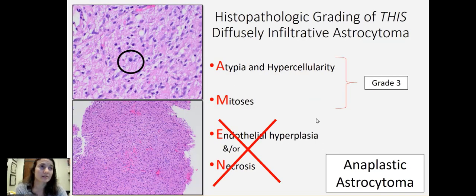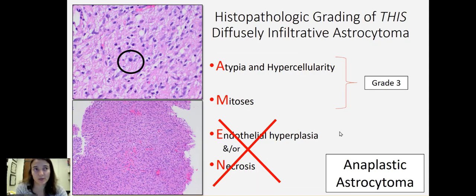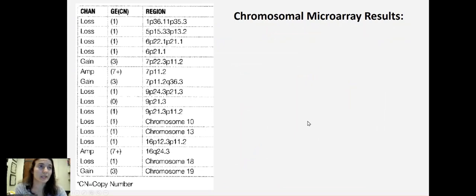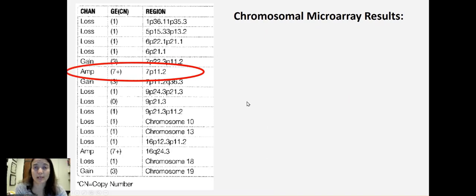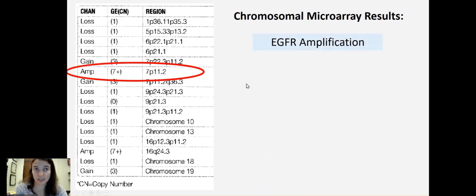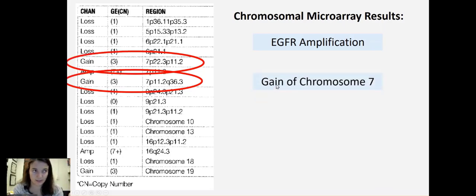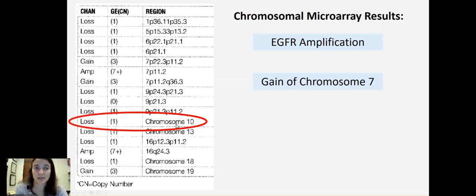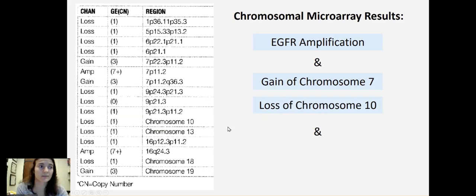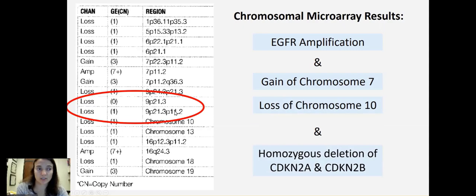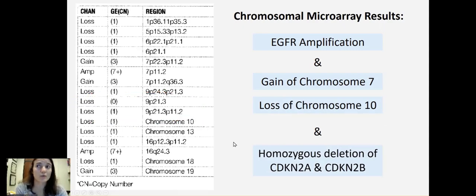If we go back to our patient, we determine that by histopathology only — just looking at the slide — we would call this an anaplastic astrocytoma, which is grade three. However, let's look at the molecular alterations for this patient. Here are the results from his chromosomal microarray. The area of the genome harboring the EGFR gene is amplified, so we have EGFR amplification. In addition, we have gains of chromosome seven. And then we've also got a loss of the whole chromosome 10 — monosomy 10. Furthermore, we've got homozygous deletion of the areas of the genome containing CDKN2A and CDKN2B. The overall results show two of the three major alterations that we can use to call it a grade four.